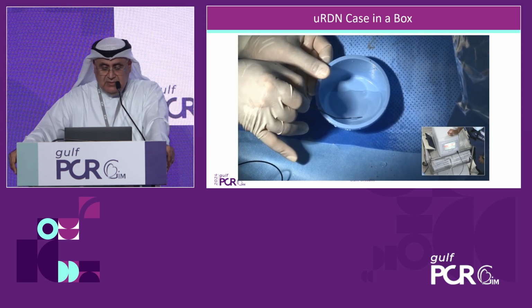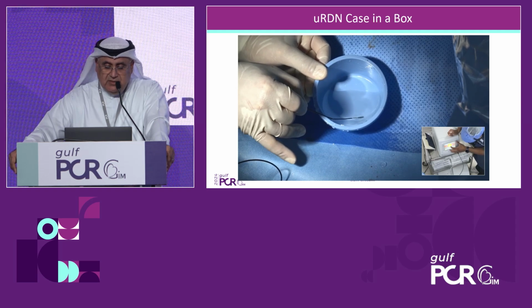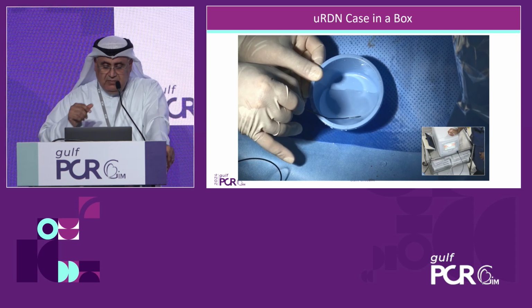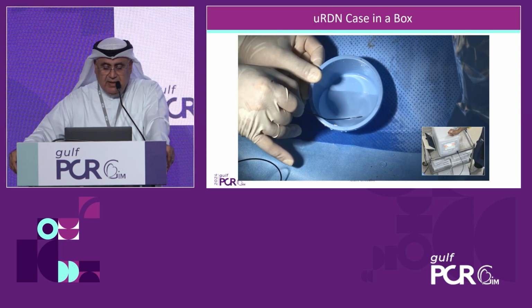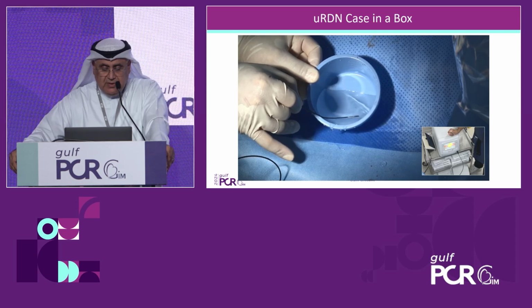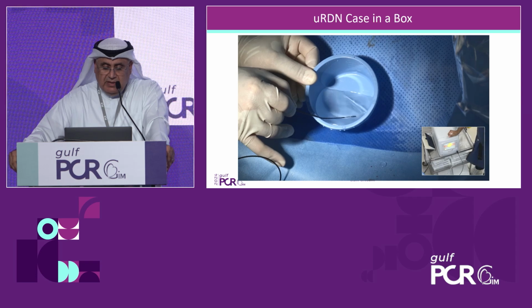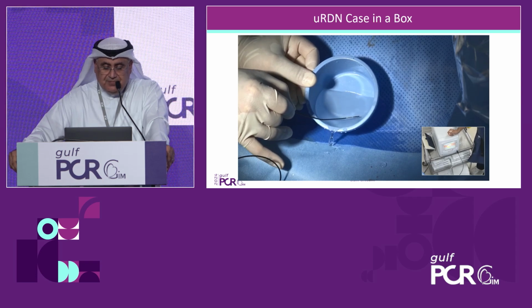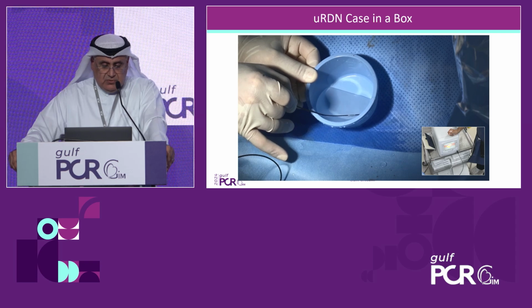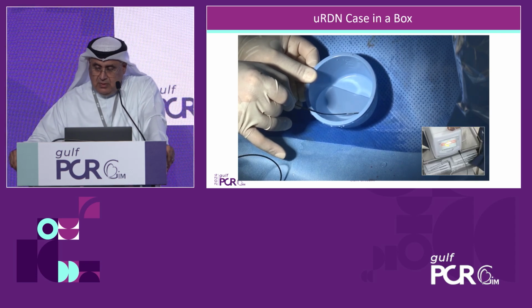In this test, we could just inflate and give some sonication, and we can see very tiny waves or micro waves that have been generated by the sonic energy. I don't know if you can appreciate that. You see there some kind of wave production. There are waves generated after delivering the energy by the balloon.